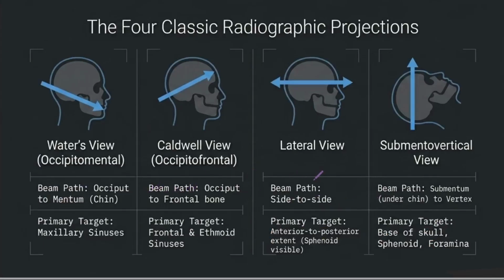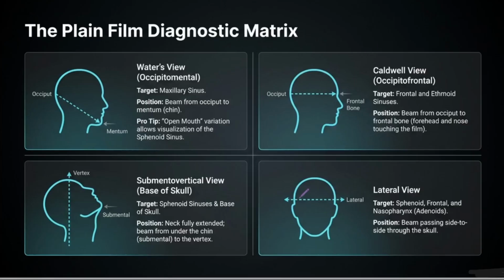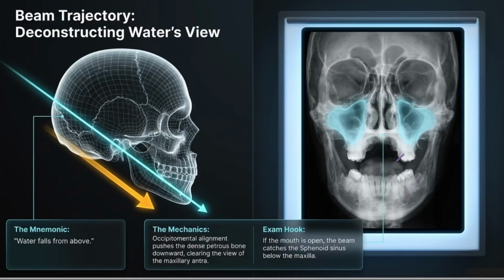A surgeon must know the map down to the millimeter because stepping off the designated path during the surgery has immediate catastrophic consequences. They are essentially scraping diseased tissue away from the literal walls of the brain and the optic nerves. Exactly. Well, here's where it gets really interesting and honestly terrifying. The stakes for a surgery that sounds so routine are just astronomical. They really are. The lecture devotes a massive amount of time to these borders. It specifically warns surgeons about these anatomical danger zones and what happens when the map is misread. Yeah, Manisha ENT's lecture basically serves as a masterclass in disaster avoidance.